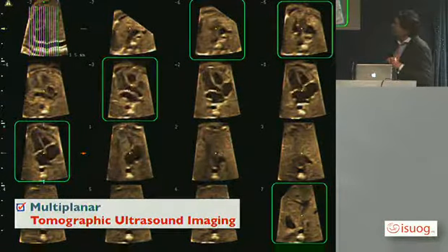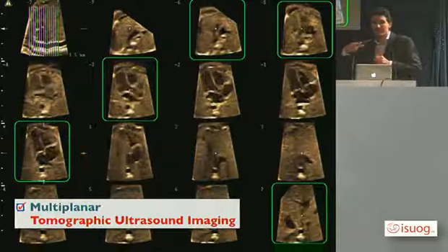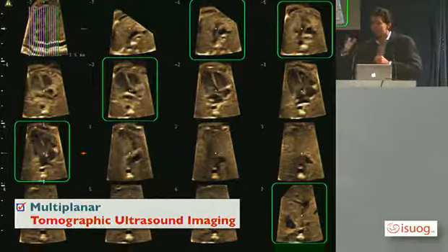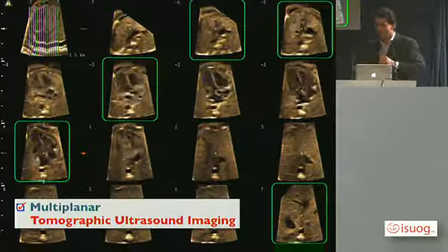It's very important to understand what I mean, because here you understand that the fetal examination can be done only by tangential examination, only parallel examination. There is no tilt up, there is no tilt to the left or to the right. Only make a parallel sweep.